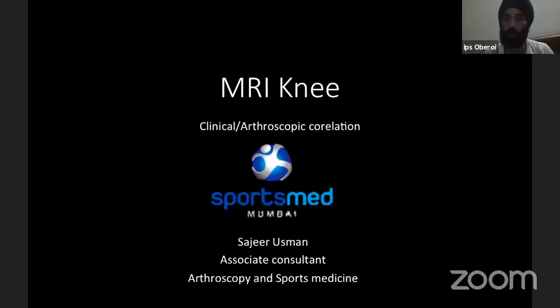A lot of times in an arthritic knee, an osteochondral defect is reported. So is an OCD kind of lesion seen in osteoarthritis, or is it essentially a subchondral insufficiency along with subedema? Yeah. So I think the key thing is what they're describing it as. If they say it's just subchondral bone marrow edema, then usually it ends up being acute exacerbation of osteoarthrosis. So acute exacerbation of osteoarthrosis is nothing but a subchondral insufficiency fracture in an osteoarthritic patient, whereas a subchondral insufficiency fracture is otherwise just that in somebody who's got good cartilage.